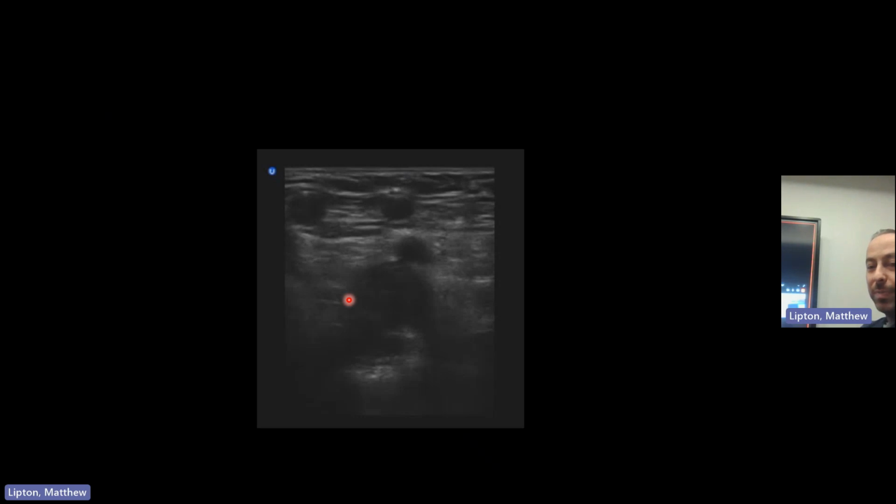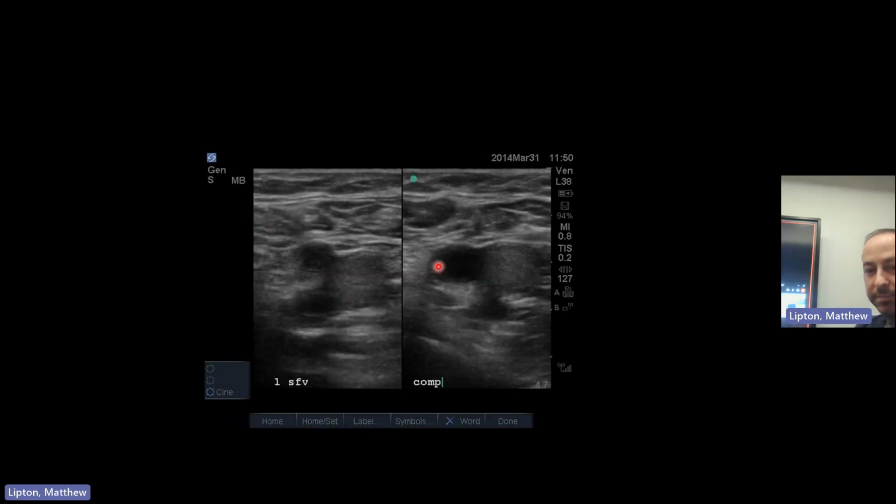And so if you are suspecting a PE and you're wondering about thrombolytics and you don't want to push thrombolytics without some form of confirmation or at least a higher probability of getting the right diagnosis, usually it's impossible to send someone to the CT scanner. We don't like to send hypotensive patients to the CT scanner. So you can do this rapidly at the bedside. You're still usually going to do a cardiac exam as well. But if you see a dilated RV with a DVT in the leg, almost certainly this is the cause of their shock.